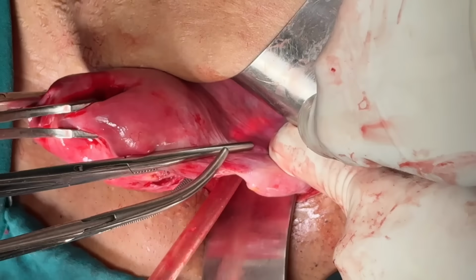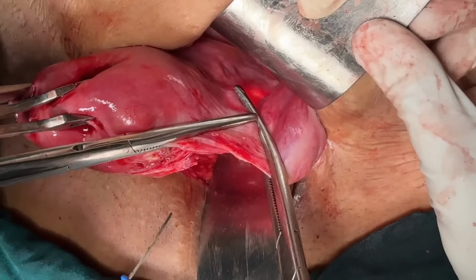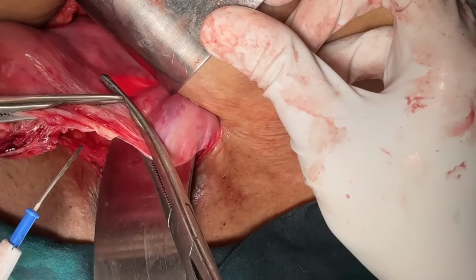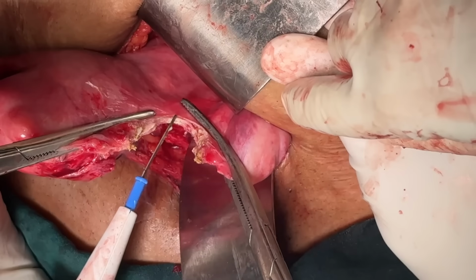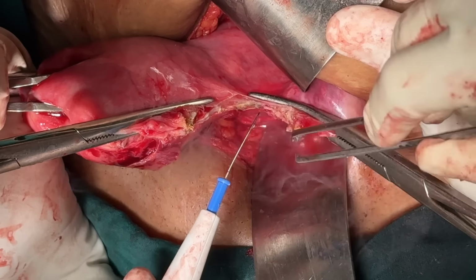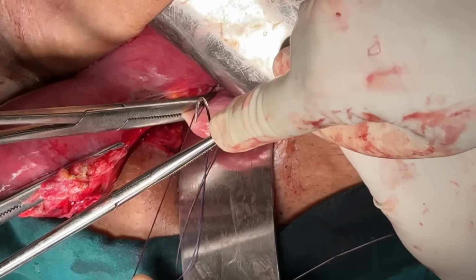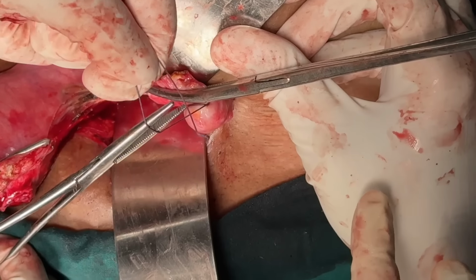And then put the clamp. Now on this side, because we are planning to retain this ovary, the clamp will be medial to the ovary, holding the fallopian tube, the ovarian ligament and the round ligament. For this pedicle, cautery can be used to cut as it is way too much outside the pelvis. Usually, to cut deeper structures, we do not use cautery. After cutting it, we have to transfix it, and the technique is exactly the same as for transfixation.